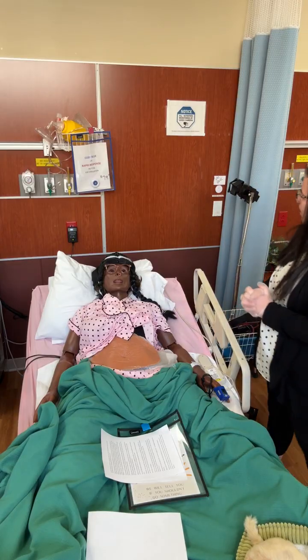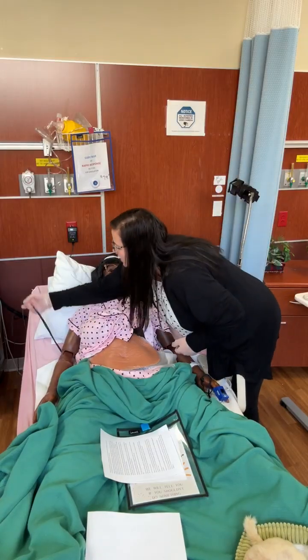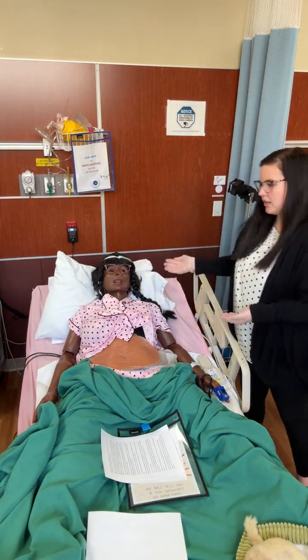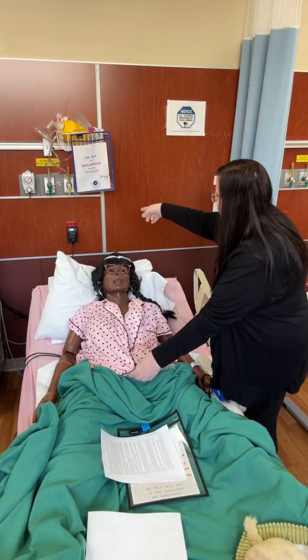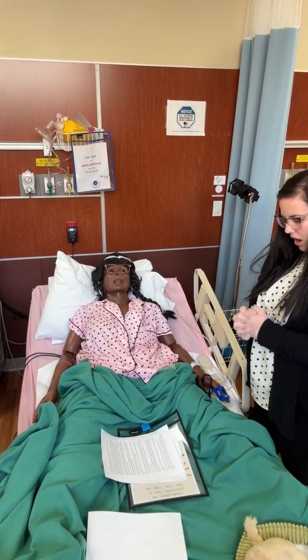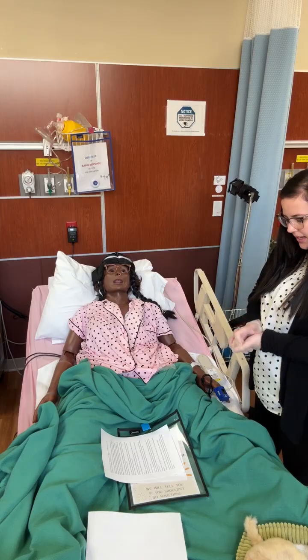Also, please make note that this simulator is plugged into the wall back here and the cords come along to the side. So if you want to raise the bed up and down, lift the head of the bed up and down, that's fine. Just be mindful of the plugs so that you don't pull anything out of the wall. Also, make sure you're wearing gloves whenever you're touching the simulator just to maintain the simulator's skin.